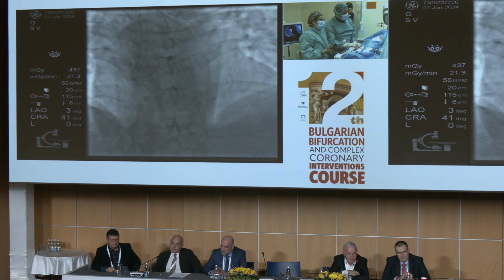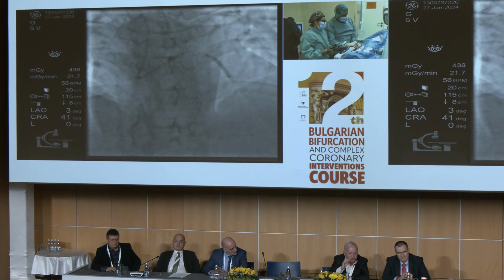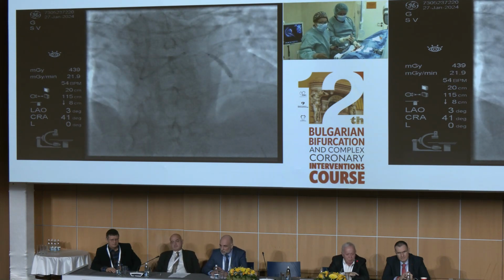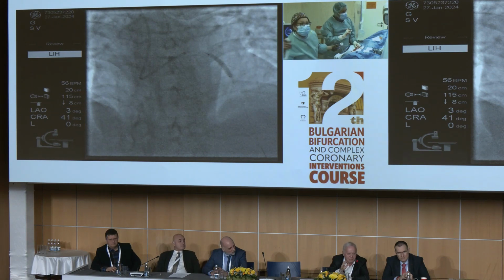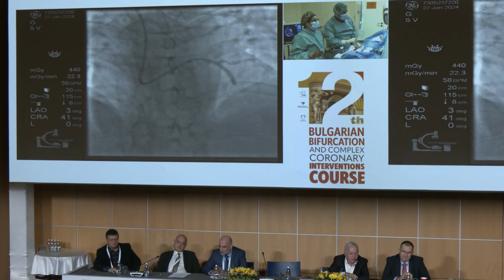Juan, do a gentle injection. Very gentle. We have not performed the pot yet. What we call a puff. A puff. Yeah, I was thinking of that.